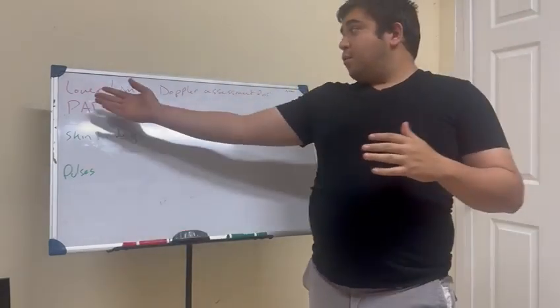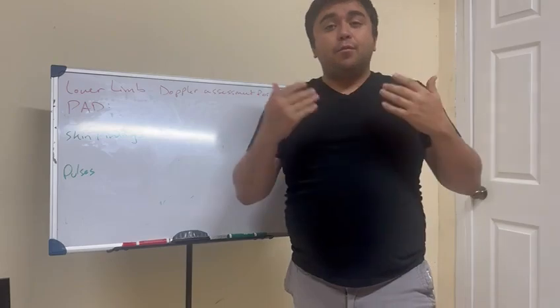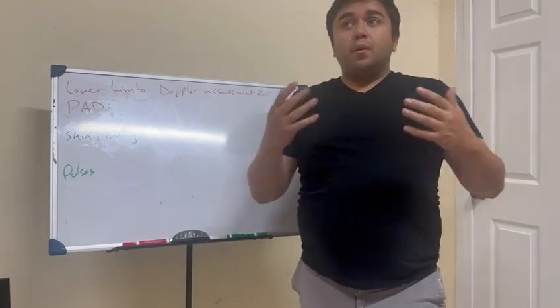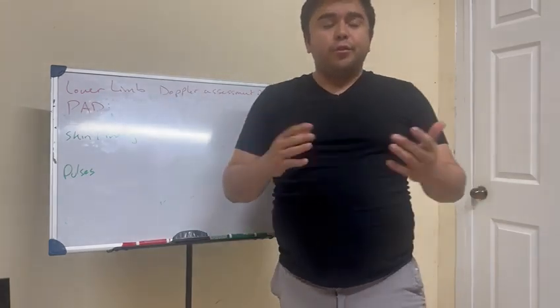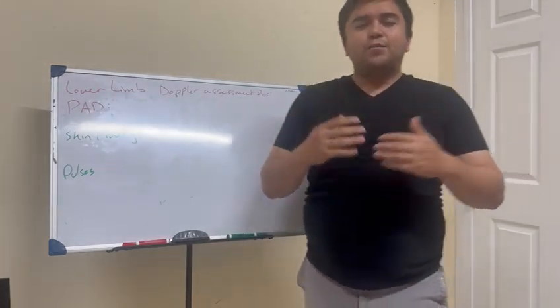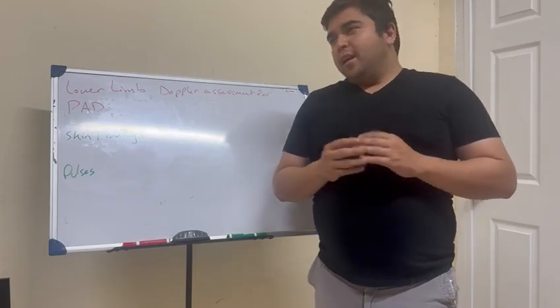Today I'm going to be talking about lower limb Doppler assessments for diagnosing PAD, or peripheral arterial disease. And you might ask, what gives you authority to do this?